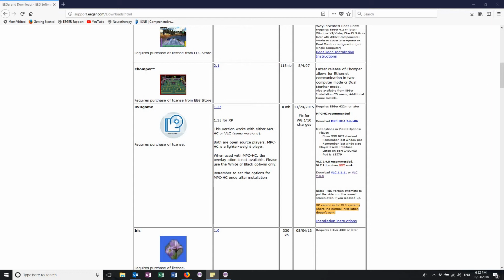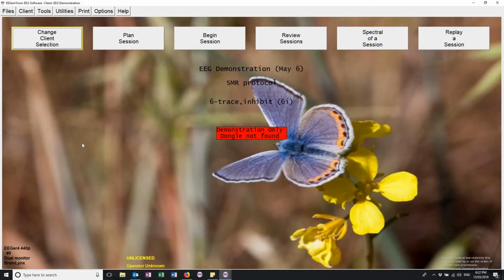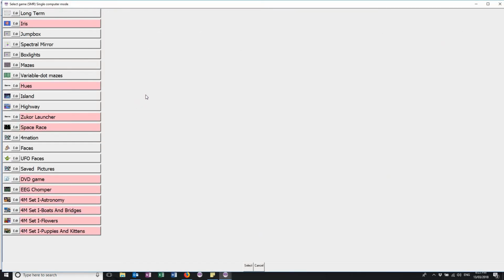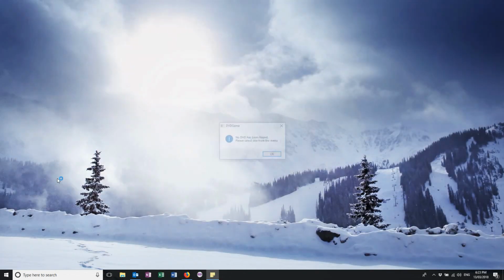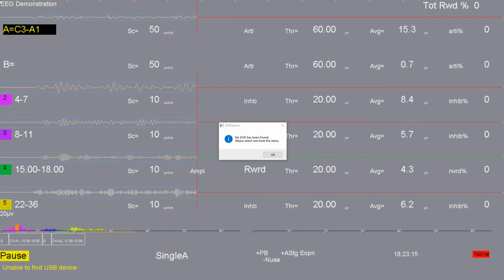So if that doesn't solve your problem, there's one last thing for you to try, and that is within EEGer, when you're running the DVD game, so you've selected your client, you've planned your session, and you click on begin session. Now we're going to do replay session because I don't have anyone plugged in. And you click on DVD game. So the last thing to try is that you do not have a DVD plugged in the drive yet. That you only put the DVD in the drive now after VLC Media Player has opened.